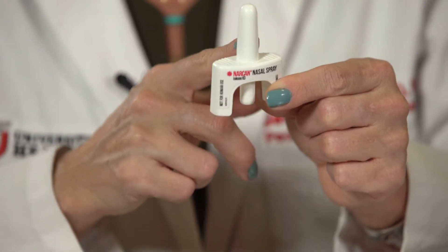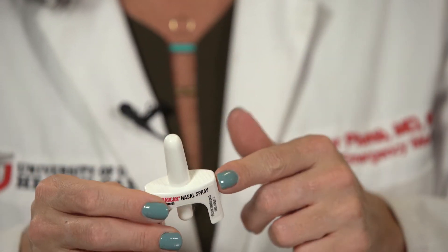Each kit that comes with this form will have two doses of Naloxone and two of these devices within it — one dose per device. And that's because, ideally, you want to be able to give someone two doses while you're waiting for emergency medical attention.